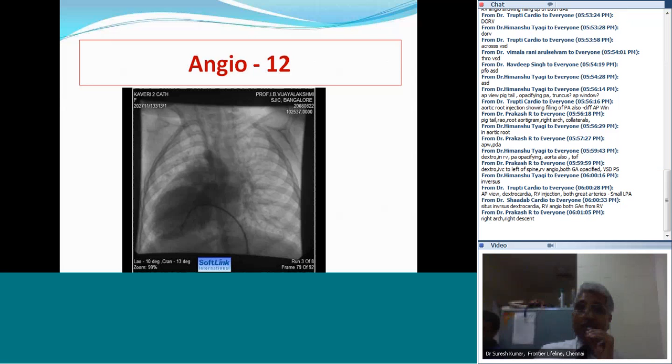And what is that smooth walled ventricle doing? That injection is showing opacification of the pulmonary artery, all right. So therefore there is a ventriculo-arterial discordance because it is anatomic LV and it is opacifying the pulmonary artery. So there is a ventriculo-arterial discordance. With the ventriculo-arterial discordance, see the valve.